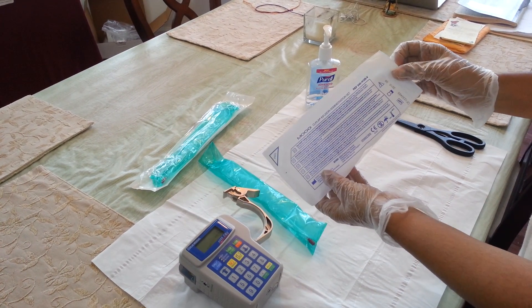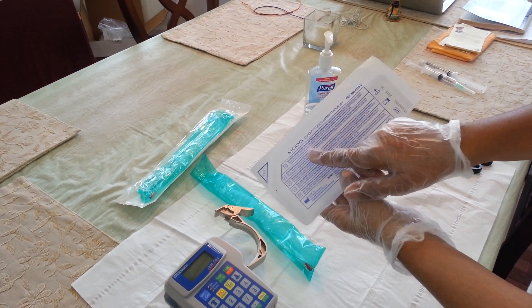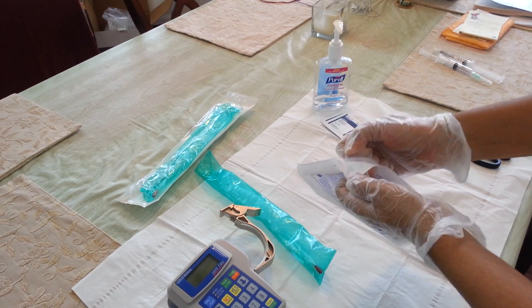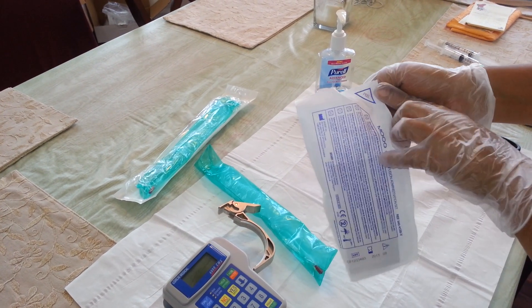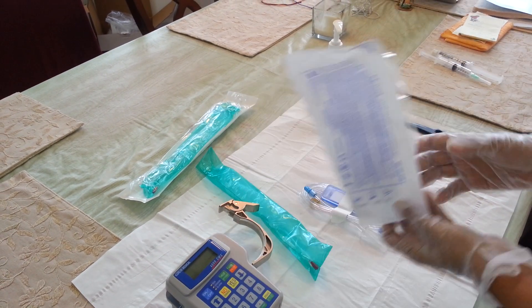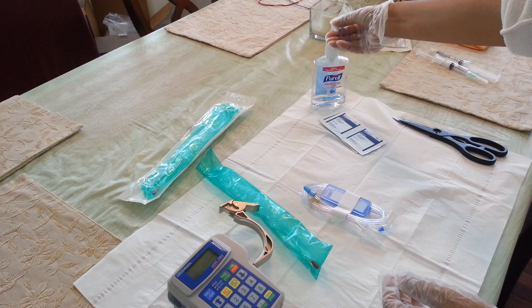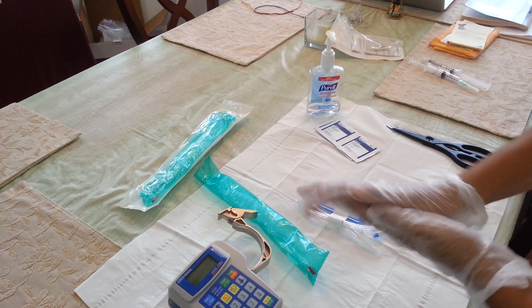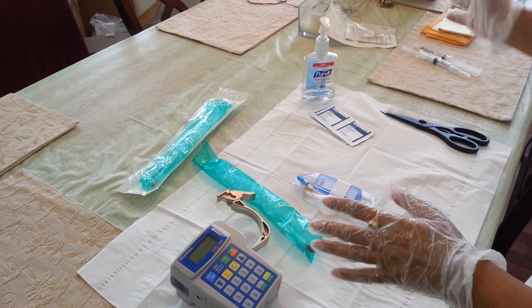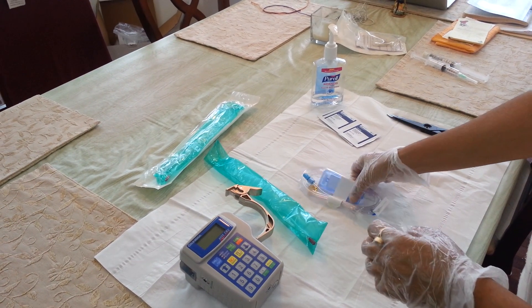This is what the Curlin administration set looks like. The brand is Moog. I am going to take out the tubing from its packaging — it says here 'peel,' this is where I open the packaging from. Before I do anything with the tubing, I am going to use some sanitizer on my hands, as the tubing is sterile and once it comes out of the package I want to make sure that it stays that way.